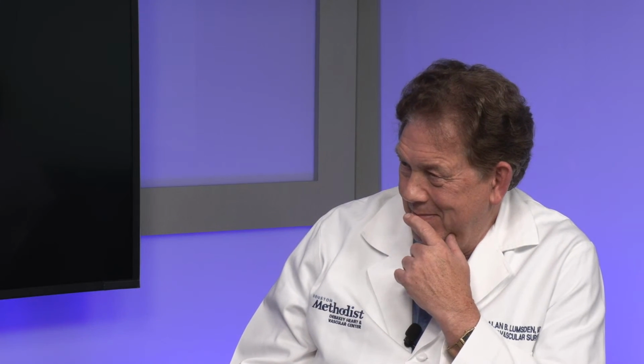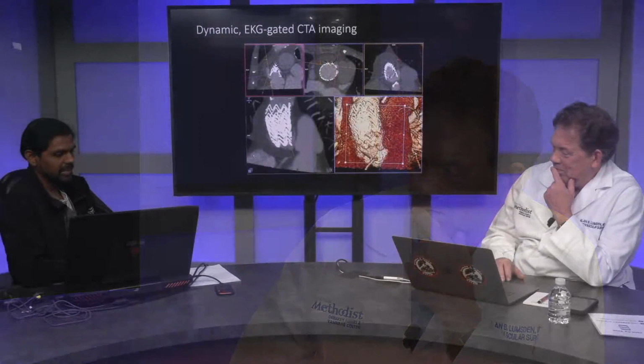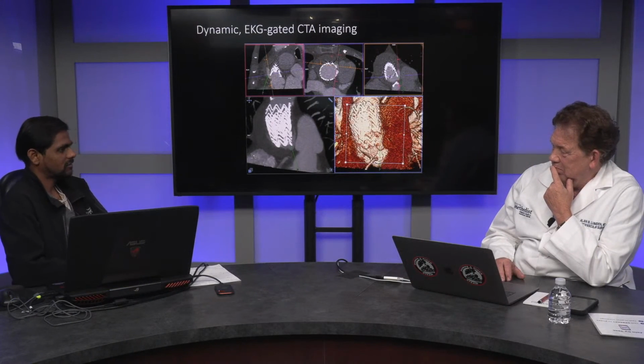MR gives you better physiologic resolution, or temporal resolution, and functional imaging capabilities. Is there a role for combining these? Yes, definitely, but the price we pay is two scans.